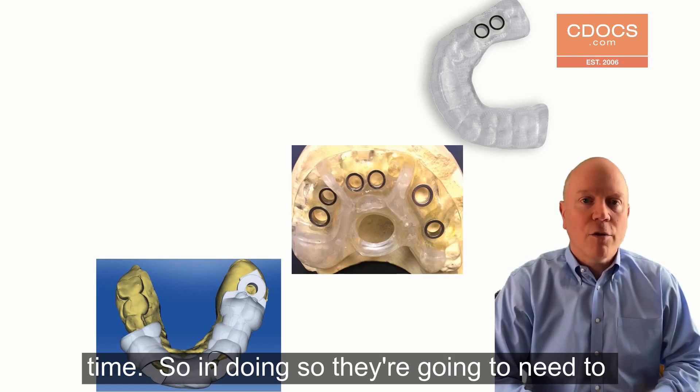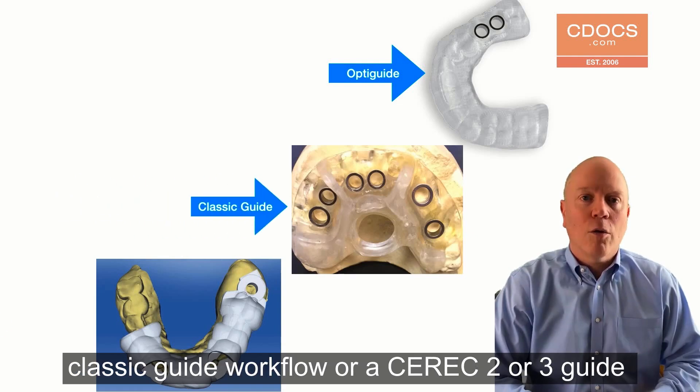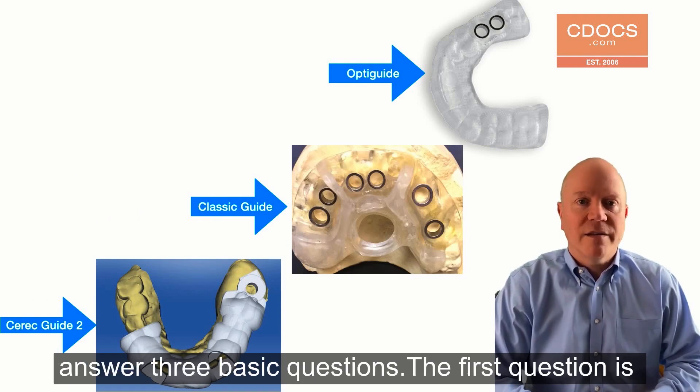In doing so, they're going to need to understand: is this going to be an OptiGuide workflow, a ClassicGuide workflow, or a CEREC 2 or 3 guide workflow? And to do that, they're going to need to answer three basic questions.